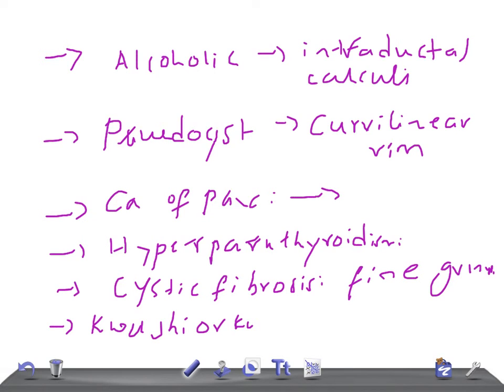Another cause is hereditary pancreatitis, which is really very important. In hereditary pancreatitis, the calcification is typically rounded and often larger than in other pancreatic diseases — this is a key distinguishing feature to remember.